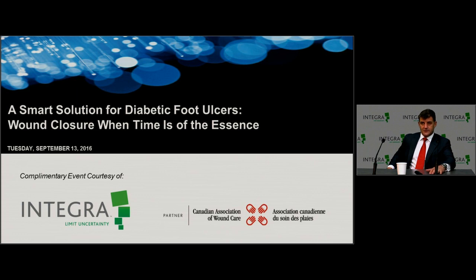And I think that's just what you have to keep in mind and extrapolate that data outward. As to the second part of that question, was other types of wounds. Certainly for dehisced surgical wounds, IDRT therapy can be ideal, especially wounds that have depth to them. Wounds over bony structures, a classic for us would be, say, a patient has had a below-knee amputation and then falls on it and has protruding tibia. We use IDRT over it.